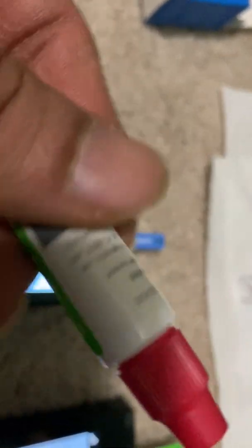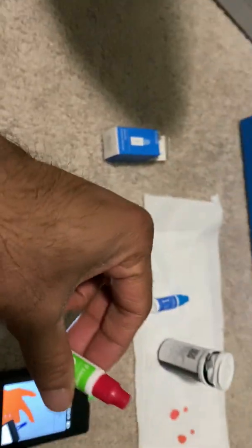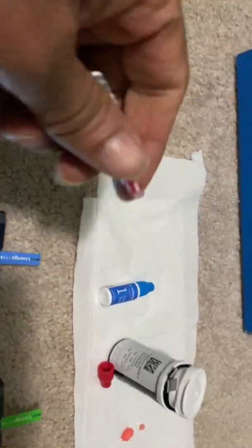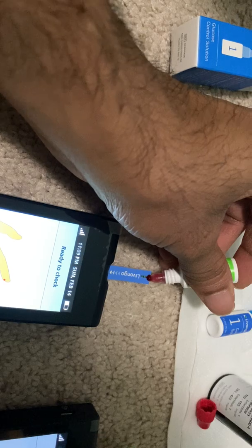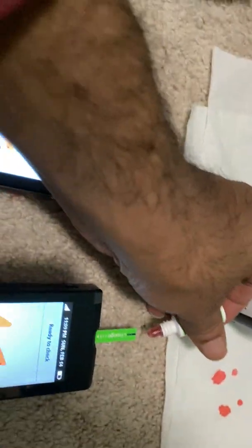Now I'll use control solution 2. I'll shake the bottle to make the solution uniform so it becomes evenly mixed. Then this is ready to check. I'll open the bottle and put a drop on each one of them and see what the difference in the readings is. So let's put a little bit of solution on this one, and on this one too.